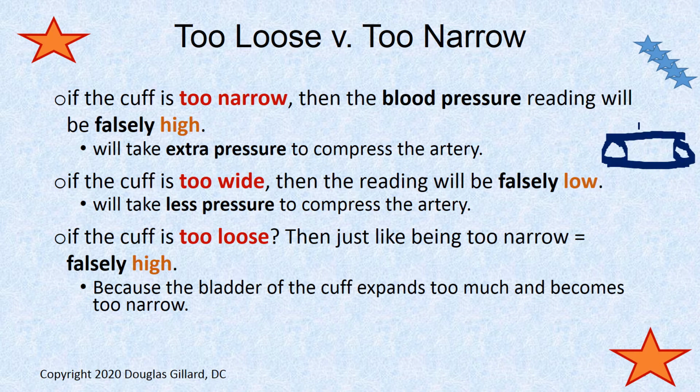And let's say this is the cuff, a little tiny thing. If you want to pinch this artery off, you have to put a lot more force to drive that little tiny cuff down. If you have a big cuff here, you don't need much force to push the artery down. So that's kind of the deal there.